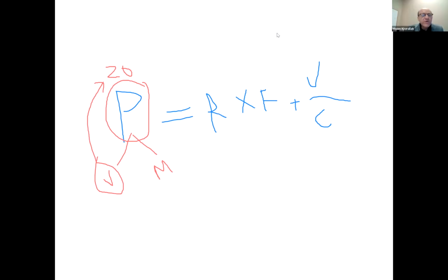So now we're fixing the pressure on the left side. Since we are fixing the pressure, we cannot control the flow anymore. So in pressure control mode of ventilation, we don't have a control on the flow, and we'll see how we eliminate that when we see the simulator. So we have only the resistance and the compliance. If the pressure is fixed on the left side in the equation of motion, the volume that is generated is dependent only on, number one, the resistance, and number two, the compliance of the lungs and the chest wall.